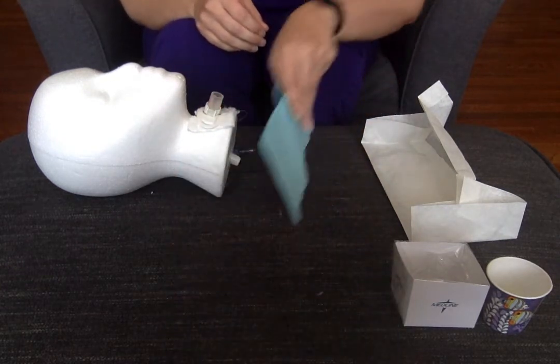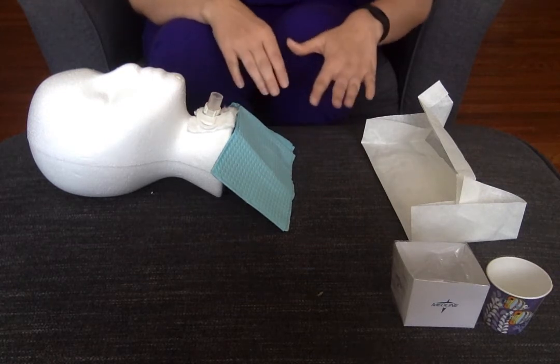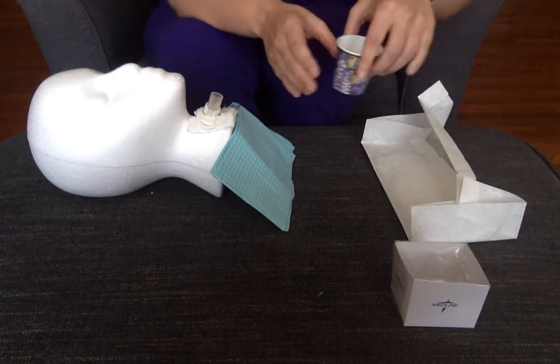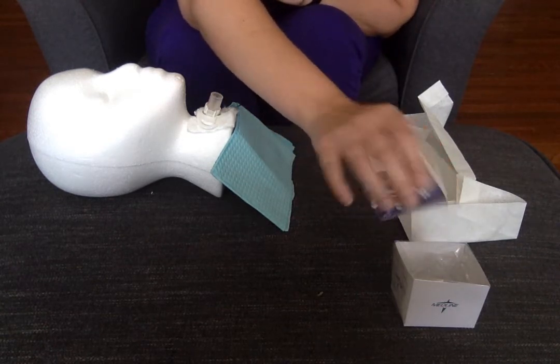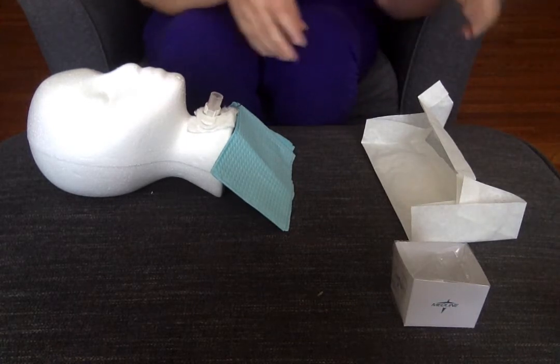I'm going to drape my patient to make sure that if they cough while we're suctioning, I don't get any sputum onto their gown — work smarter, not harder, save yourself a little time. While I have two hands, I'll also go ahead and open my saline pour bottle and fill up the little cup with sterile saline solution, and then get everything else prepared that I need.